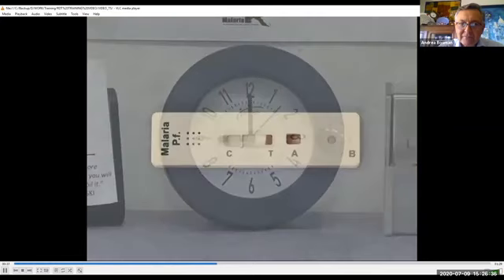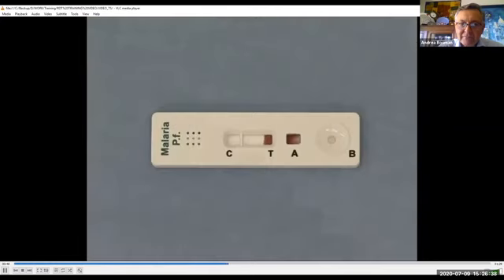While you wait, you can see that the blood is beginning to wick up the strip. It is disappearing from the sample well A and beginning to appear in the rectangular results window. Then the blood also disappears from the results window. It will leave only the control line, and if the test is positive, a line in the test window T.